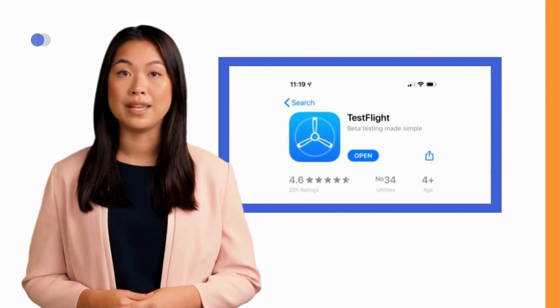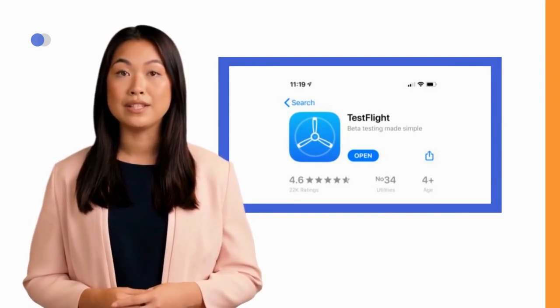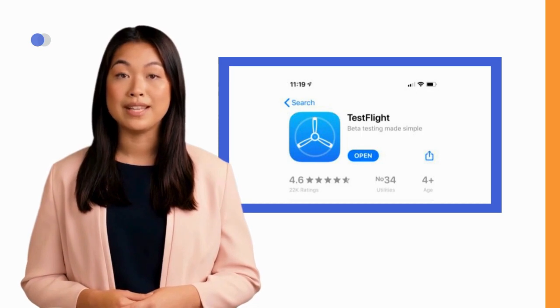Some people don't build the iAPS app themselves, but are invited to use it via a TestFlight invitation. T1 Pals and BC Diabetes from Canada are possible suppliers of this type of iAPS onboarding. TestFlight users do not need an Apple developer license.